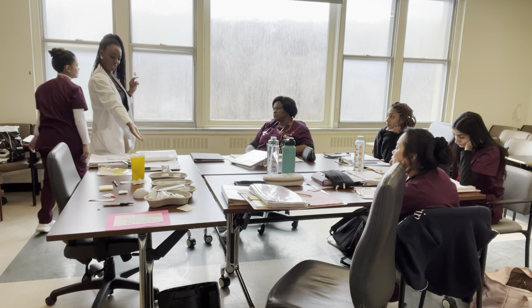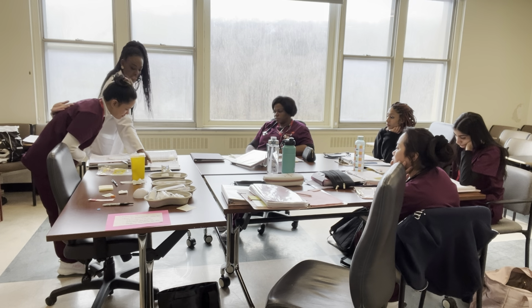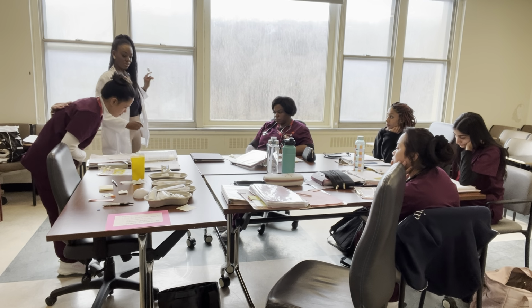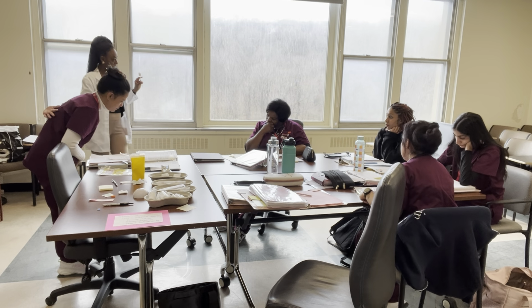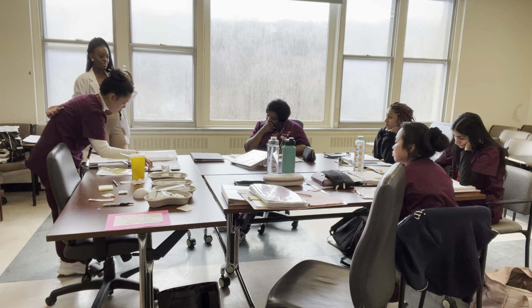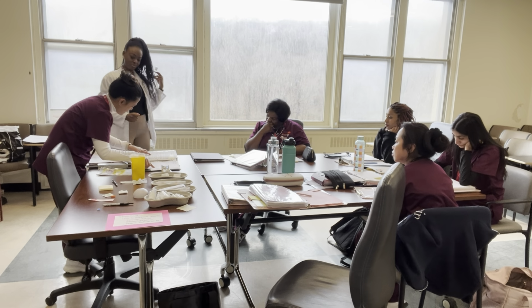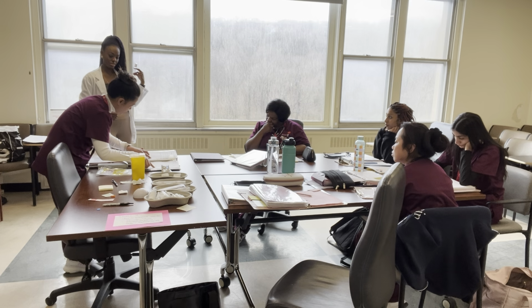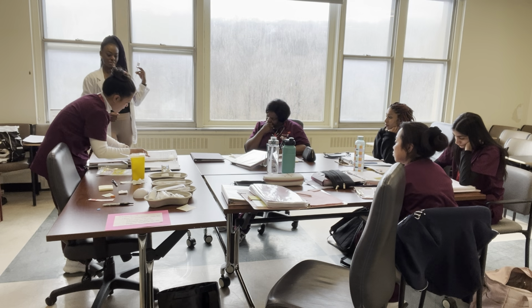So now, Anna, you have to go and look at the paperwork to make sure that I have the right amount. So it's this, and I got 10.2 millimoles as the blood sugar. So she has to do her own independent verification to see how much I should have in my syringe. Does that make sense? So what did you come up with? So 10.2, and then on the sliding scale, it's 2 units of Humalog, and then the baseline is 3 units, so we're going to get 5 units of Humalog.